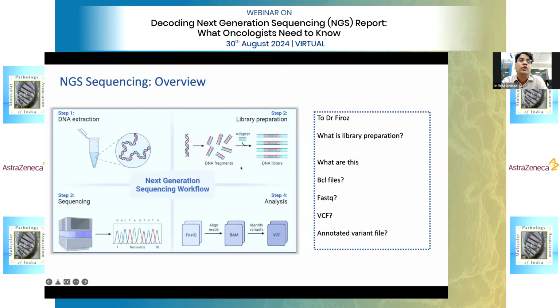But because of targeted treatment, the cost difference is now almost negligible. DNA and RNA are almost the same now, because the panels being offered come in the range of 15 to 20,000 on average.